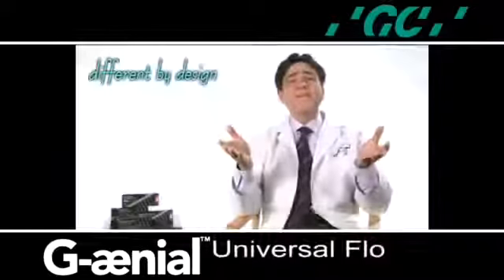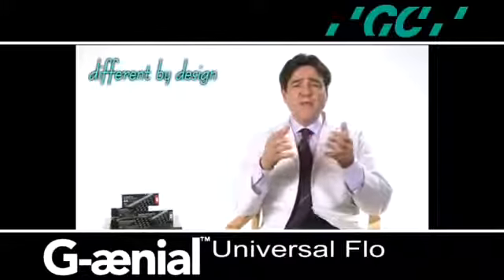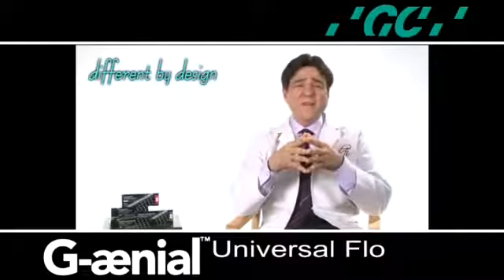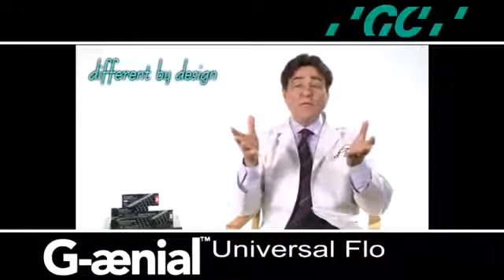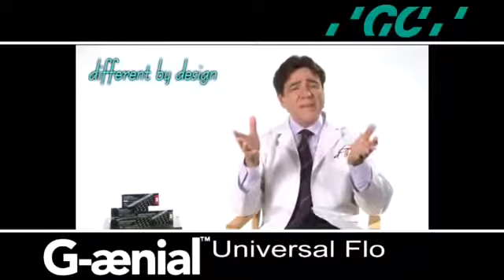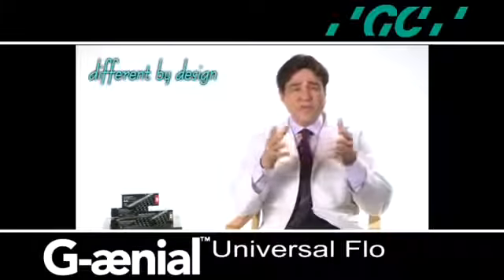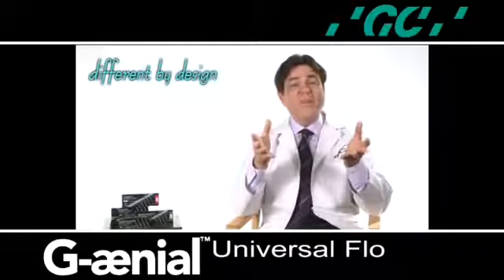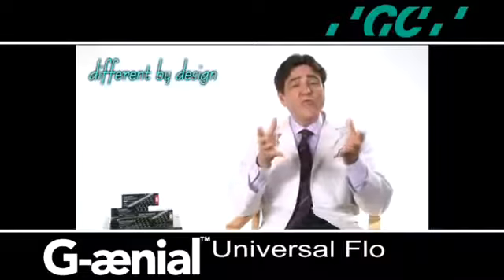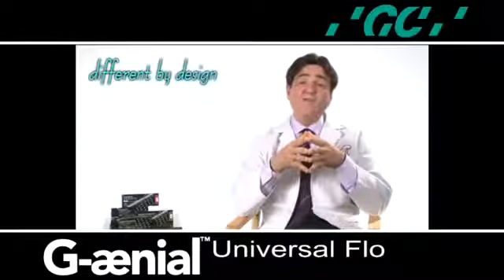Today, improvements in resin chemistry technology, optimization of material properties, and the development of innovative techniques for placement have made composite resin more user-friendly and reliable. Until recently, the flowables were clinically indicated and acceptable as filling materials in low-stress applications such as cavity liners, sealants, preventative resin restorations, small class 1 restorations, class 2 substructure, small class 3 restorations, and class 5 restorations.